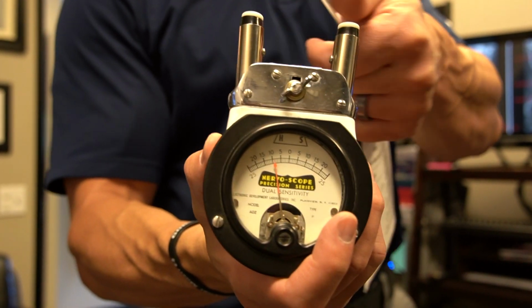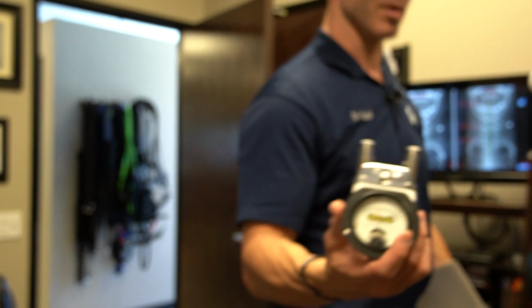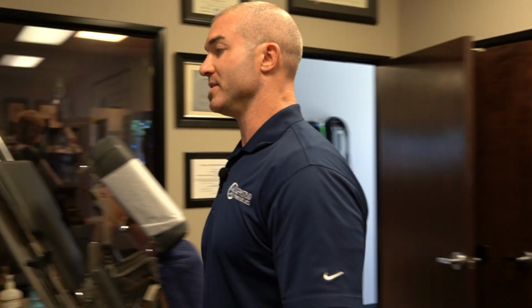This helps us locate what area of the spine there could be a problem. Keyword is "could be," because that's one of a handful of criteria that we use.